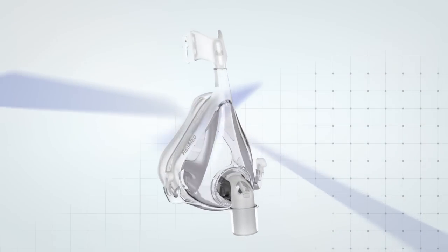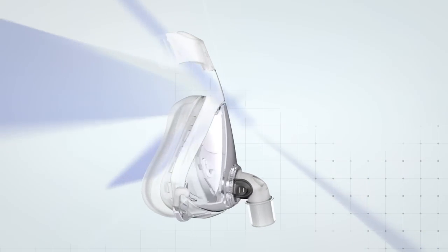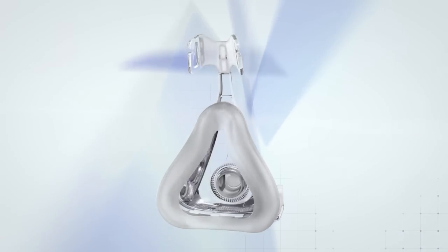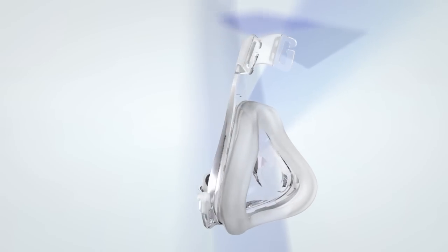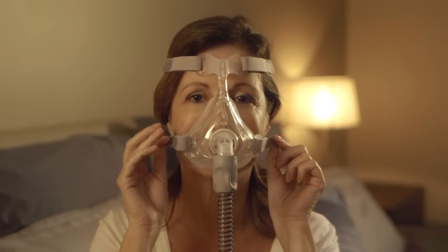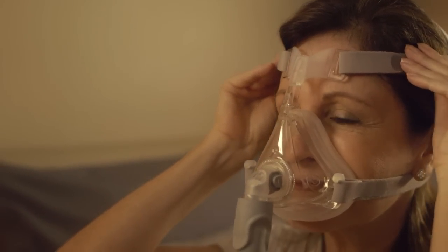Congratulations on purchasing your Quattro Air for Her mask. It should work just fine all of the time, but here are some tips if you ever encounter a problem. If your mask is uncomfortable, it could be that the headgear straps are too tight. Readjust the bottom and then the top straps evenly, ensuring they are not too tight, as your mask is designed to seal with low headgear tension.